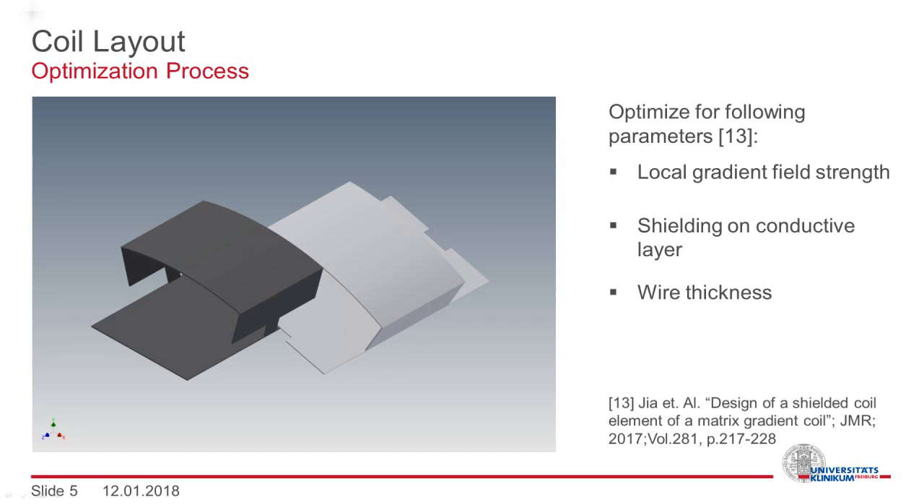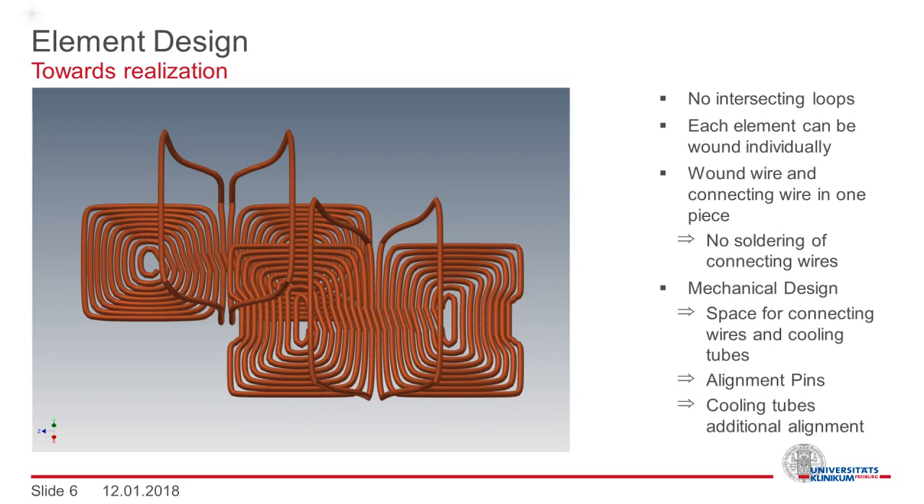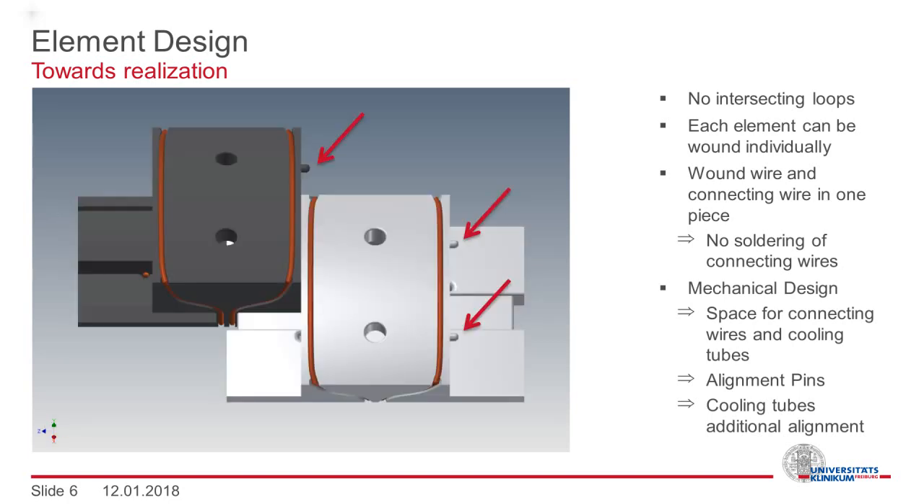Additionally, the wire thickness was taken into account. You can find more on this optimization in a paper by my colleague Fang Jia. In the resulting design, there are no intersecting loops, which means that each element can be wound individually. The same wire used to wind the coil can also be used for connecting it, meaning there is no need for soldered interconnections inside the coil. In the mechanical design, additional space for connecting wires and cooling tubes was included. There are also alignment pins, and the cooling tubes provide some additional alignment.